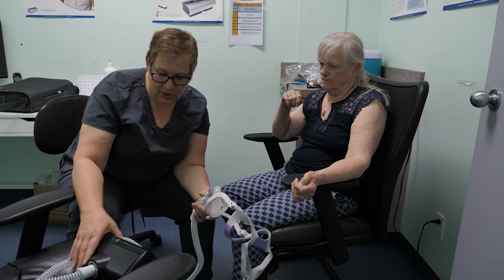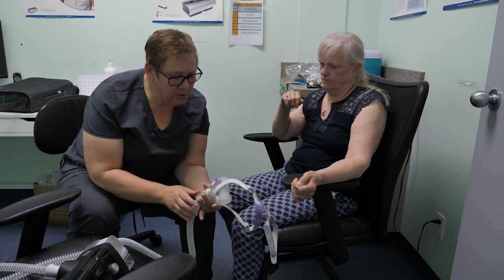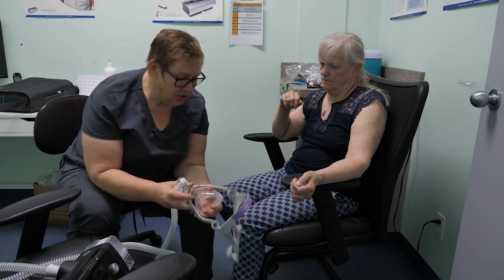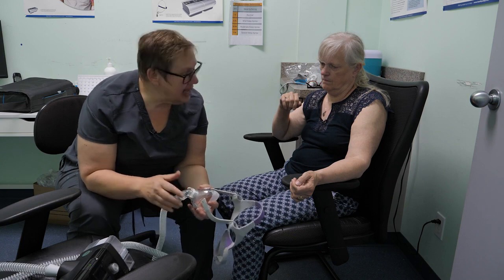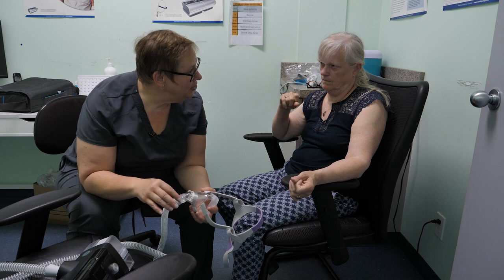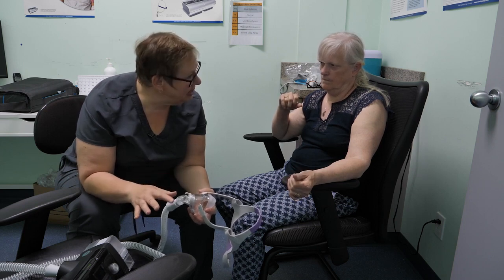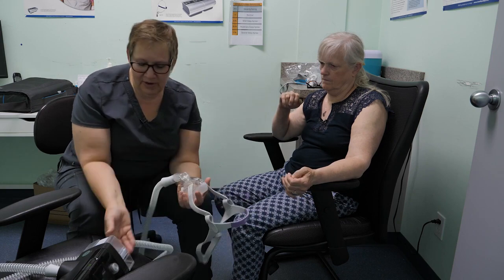Once a week, you are going to take your humidifier, your hose, and your mask, and you can take it apart as I showed you, all right? And you're going to let it soak in a sink with warm water and a cup of vinegar and a couple of drops of a mild dish soap. Just let it soak for about 15 to 20 minutes, and then you can get in there with a cloth and wash out the humidifier chamber.